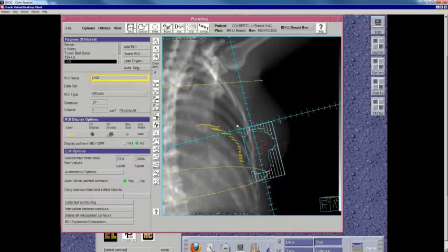It also still freaks me out a little bit to do PBI in these patients who've had real reduction mastopexies, because you don't really know if all the tumor bed is really next to those clips, and you don't really know if some of it could have been moved around further. So I would be very reluctant to do PBI in this patient for those two reasons.